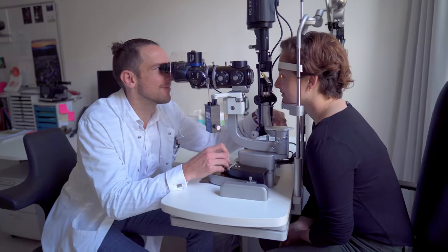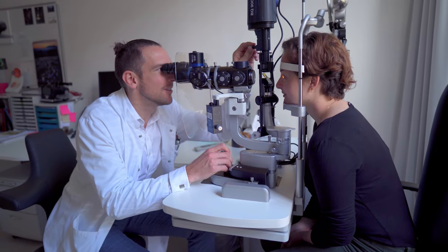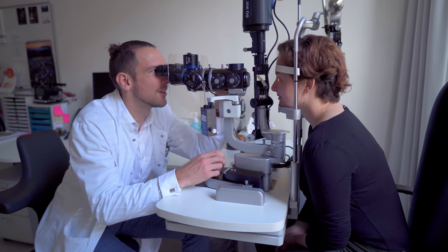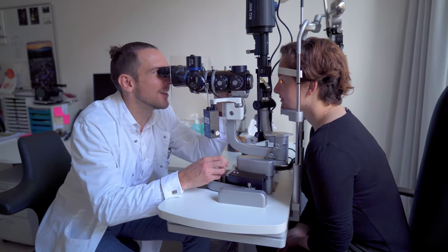Hello and welcome back to learnaboutice.com. In this video I'm gonna give you all the tips you need to quickly perfect your slit lamp fundus exam. The slit lamp exam is one of the most important skills of an ophthalmologist and you will start learning it in your first week of training.